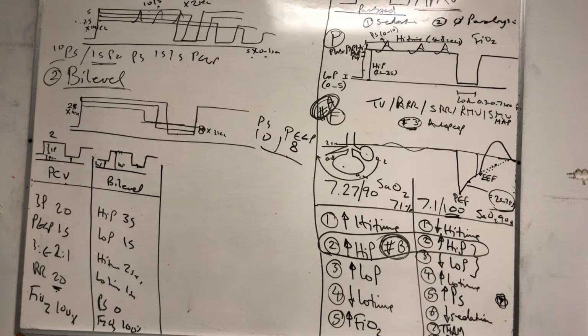Great. So that's amazing. So why did we switch? Why did we switch all the modes of ventilation to bi-level? That's a huge decision, to actually say everybody who comes to this ICU is going to be on bi-level. That's crazy, right? But why did we switch? Obviously, all the advantages and the 8 claims to fame that I told you in this lecture, but add to it another claim to fame, the 9th, which happened to us when we were doing pressure control.